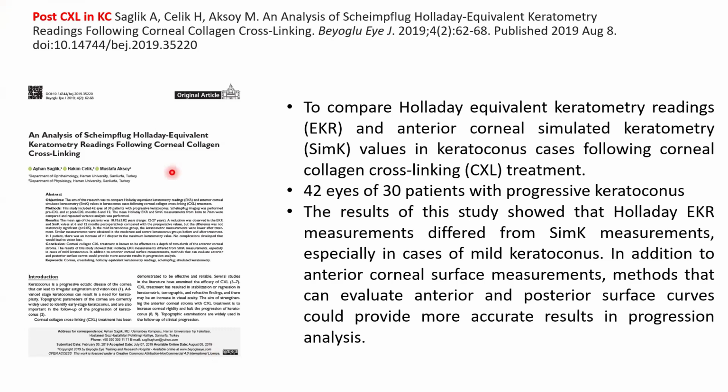Another study conducted by Saglik et al., in which they analyzed Scheimpflug Holladay EKR values following CXL. The aim of the study was to compare Holladay equivalent K readings and the anterior SIM-K values in keratoconus cases following corneal CXL.